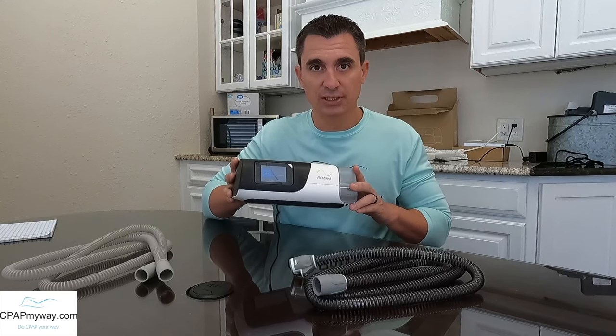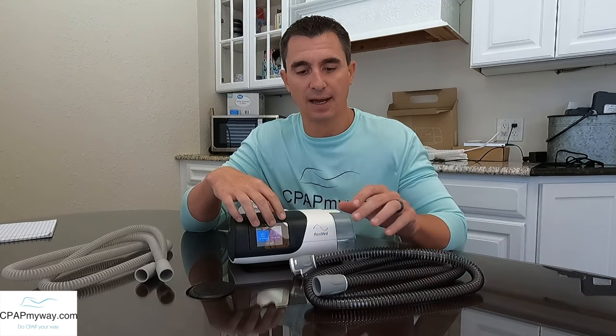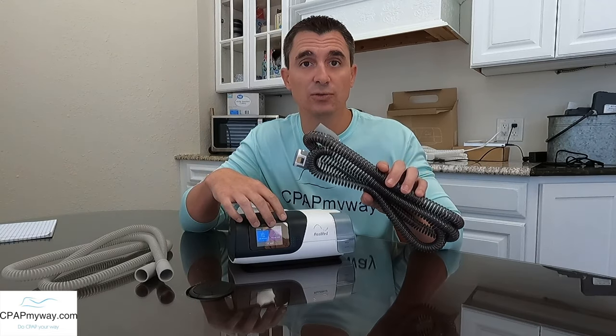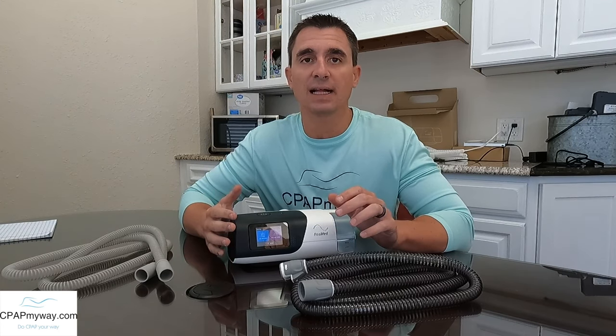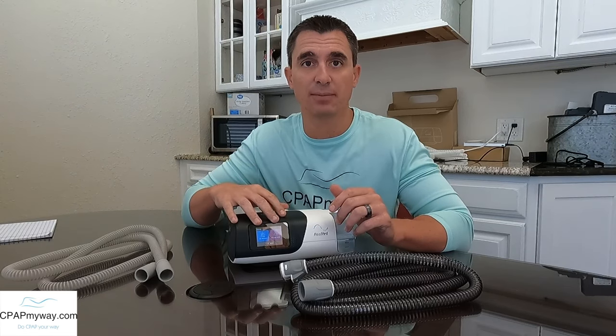For today, I'm just going to show you the AirSense 11. Almost all new home CPAPs — the most recent versions — have the ability to use a heated tube. Heated tubing has been available for probably almost three generations of CPAPs now, so more than likely it is an option for you. Additionally, if you've received a CPAP recently, you probably got it with heated tubing.